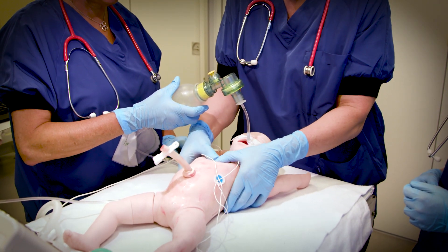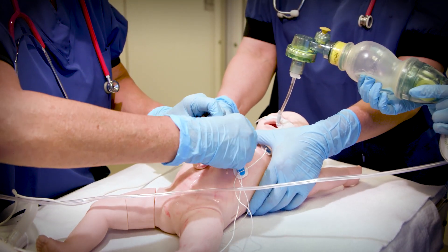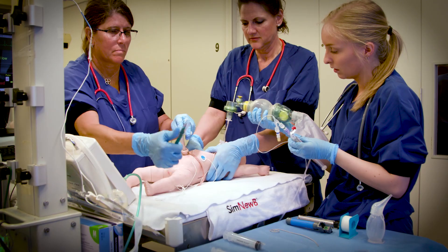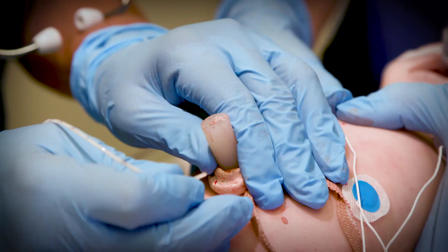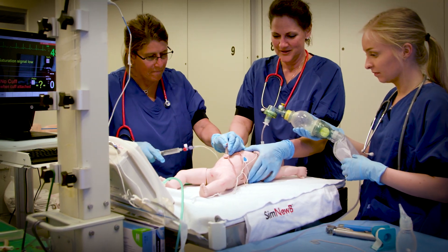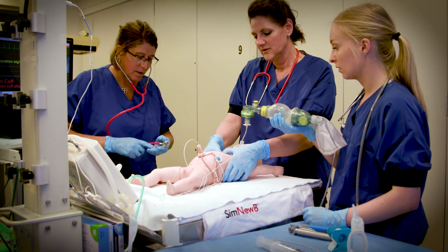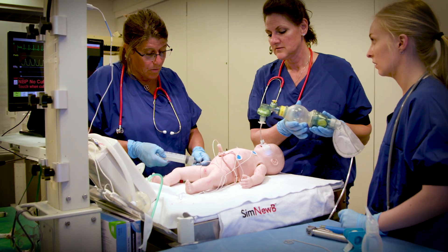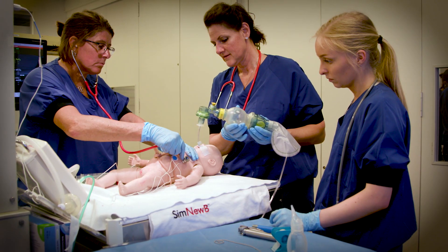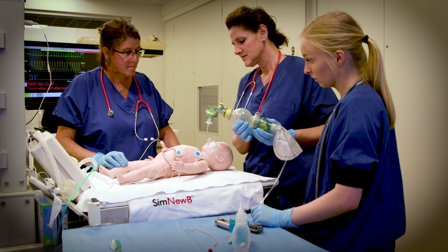Don't start until the tube is secure. And three, three. One, and two, and three, and three. [Continued rhythmic compression counting: One, and two, and three, and three — repeated throughout compressions.] It's going up.